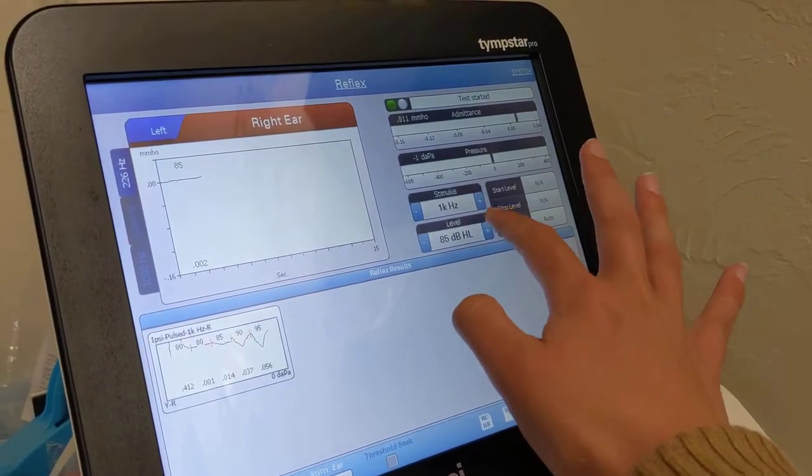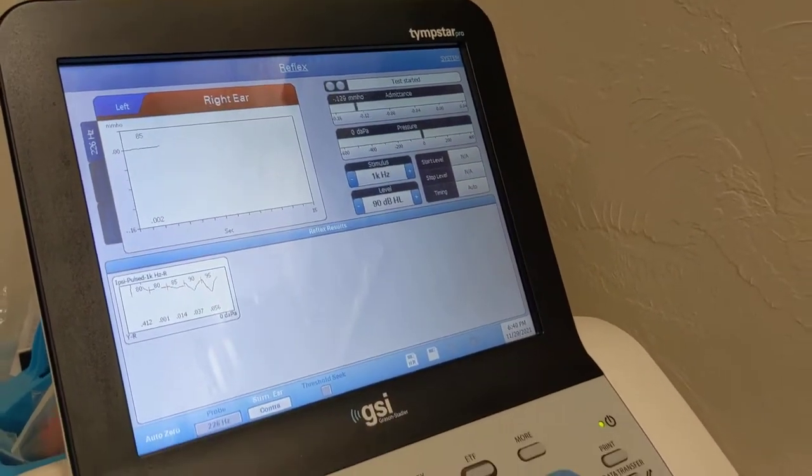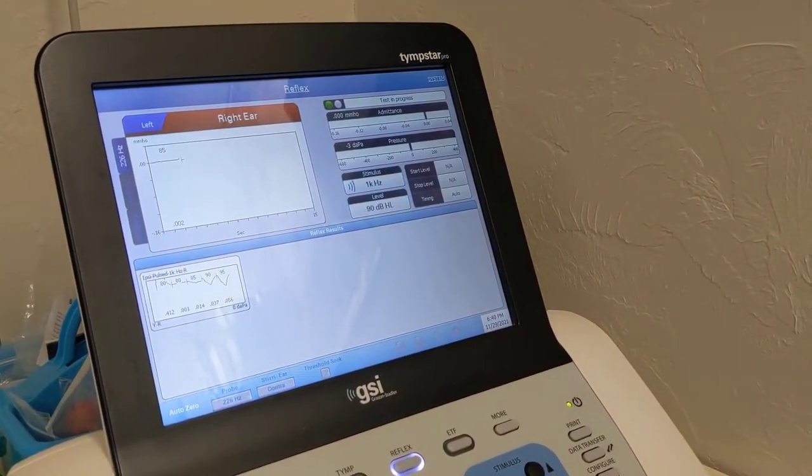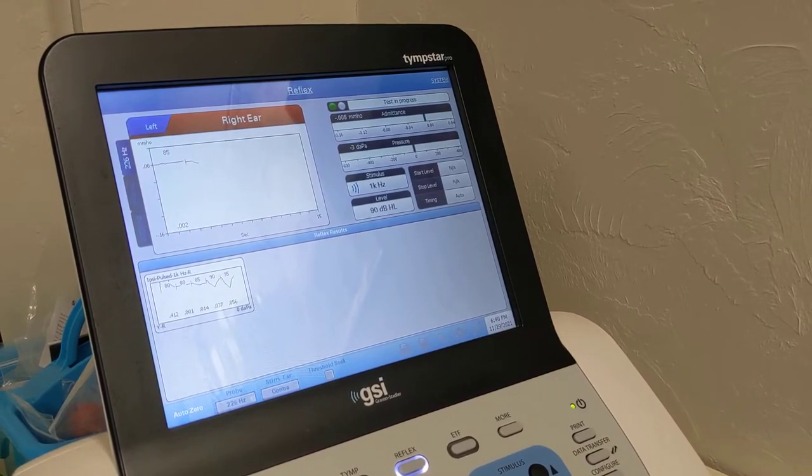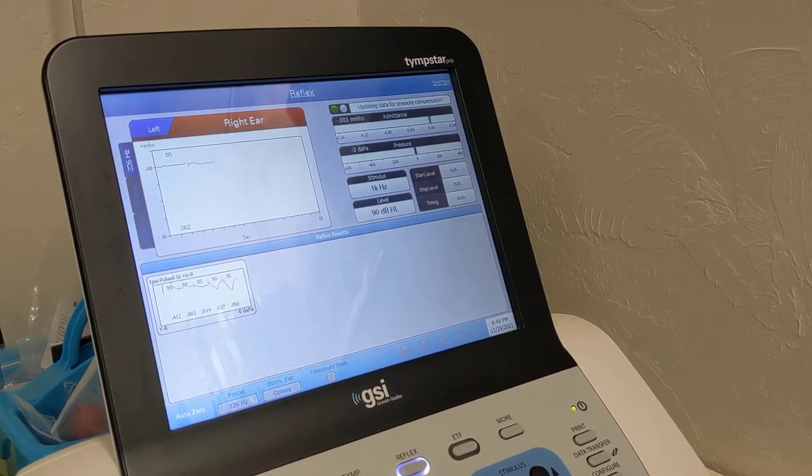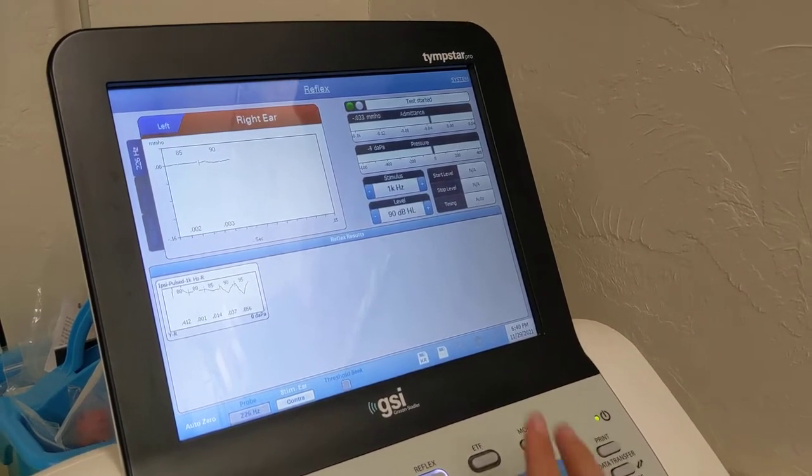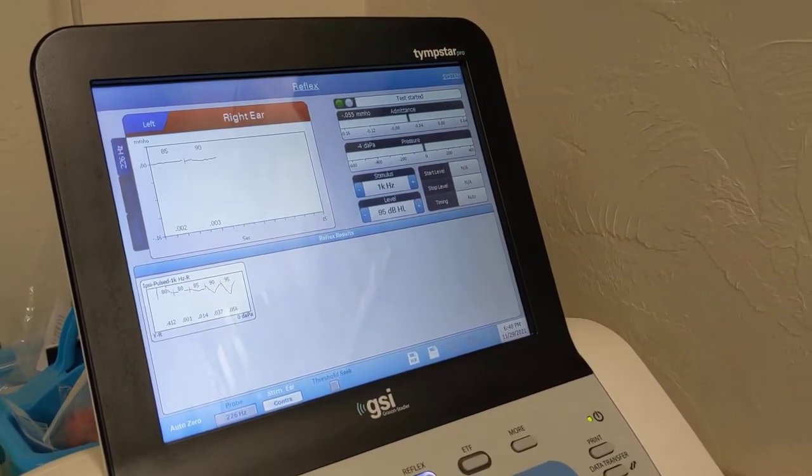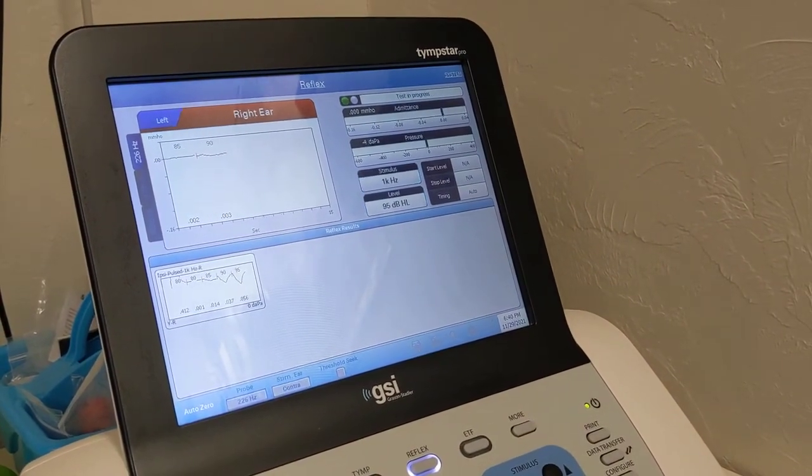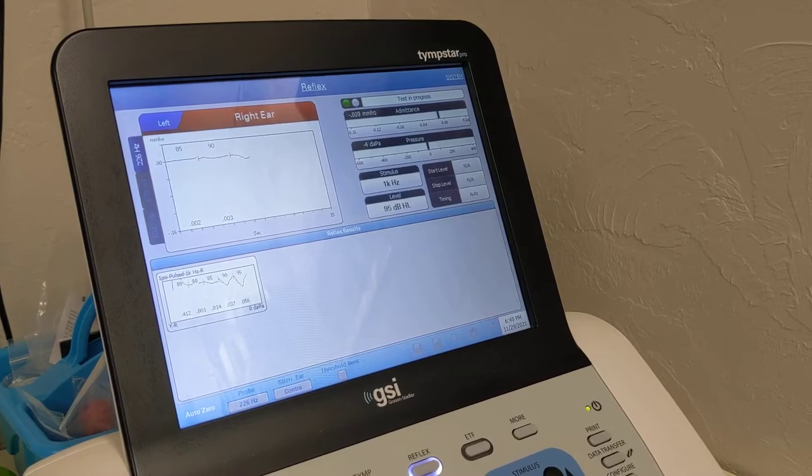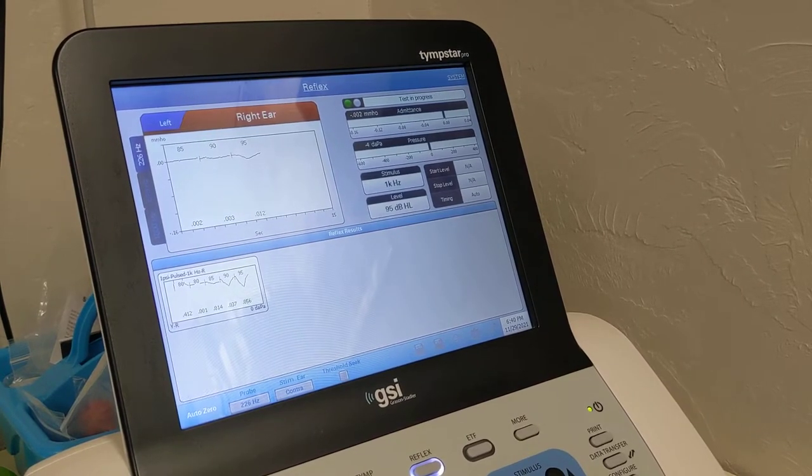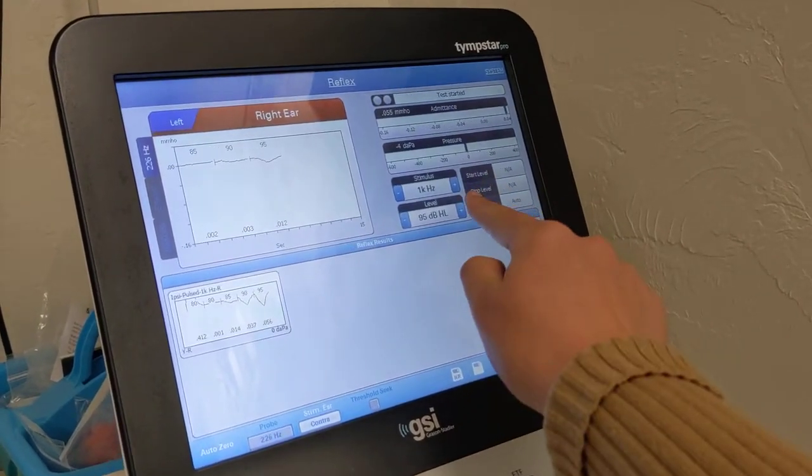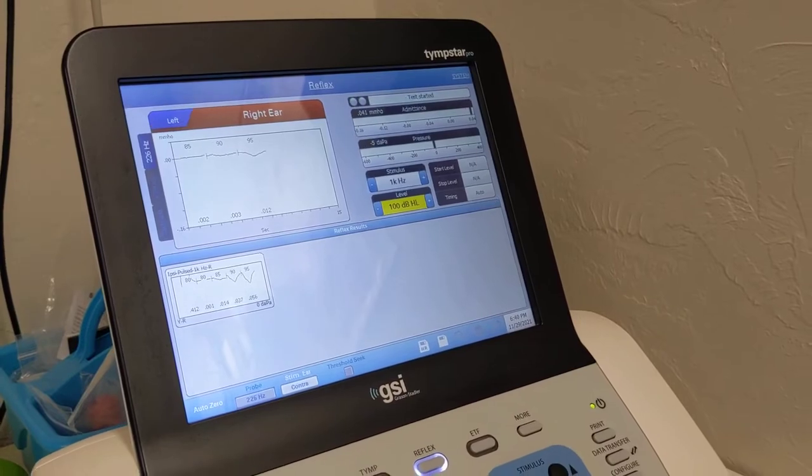All right. Increase by 5 dB and present. We'll increase by 5 more and present. Okay, try 5 more and present.